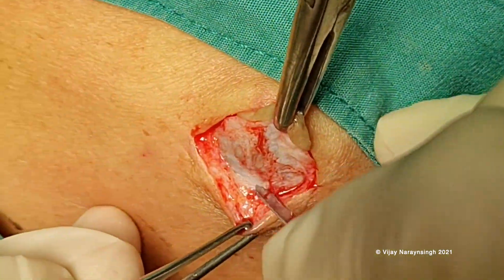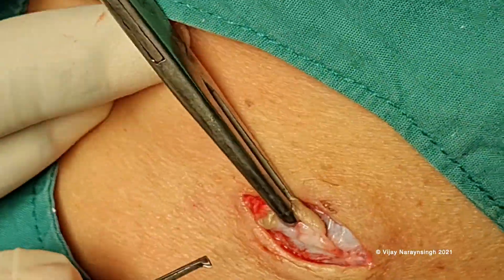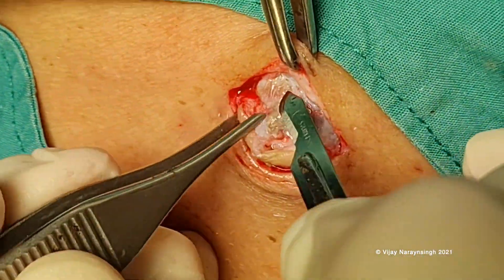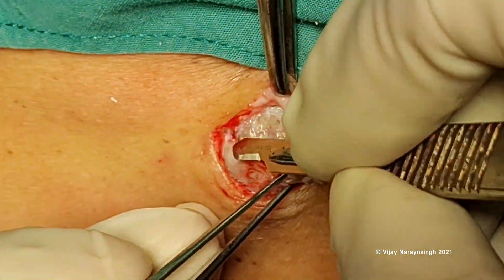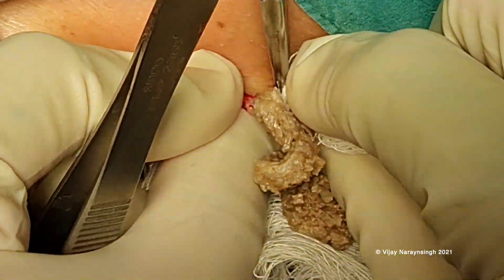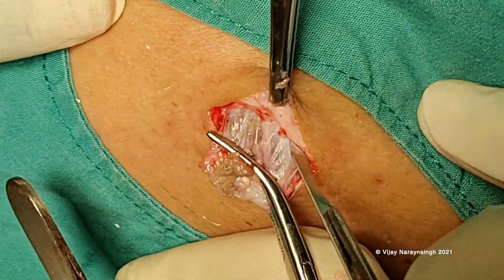When the upper half of the cyst is completely exposed, we then rupture here — the part nearest the skin — and express the sebaceous material in order to get the cyst to collapse. The wall will then not be as tense and prone to rupture as it normally is. Here we are cutting into the cyst at its uppermost part, squeezing out a lot of the contents. So now the cyst wall is less tense, less likely to rupture, and we control it with an artery forceps, which will still give us traction.